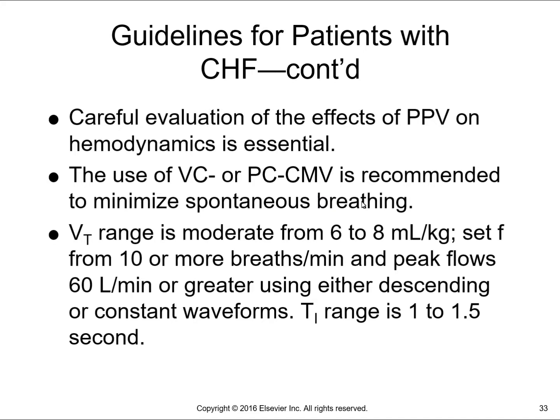And we talk about hemodynamics more at the end of the term. Okay, so the use of volume control or pressure control is recommended, and it's CMV. Tidal volume range is moderate, from 6 to 8, so that's still the same. Frequency 10 or more breaths, that's kind of the same. We normally go 12 to 20, so they're saying 10 to maybe 16, 15.